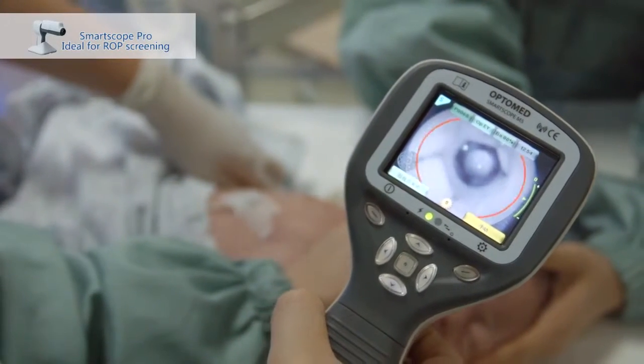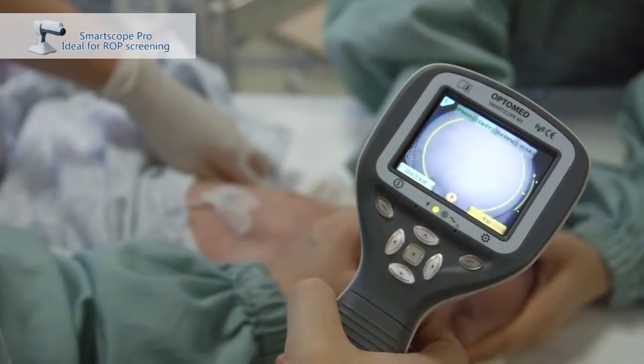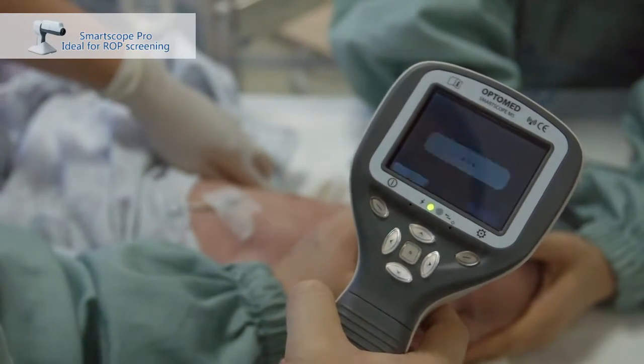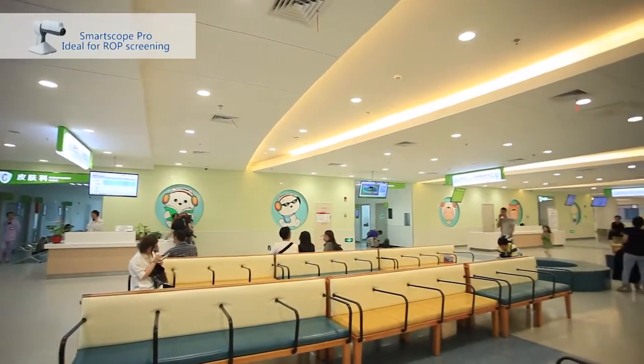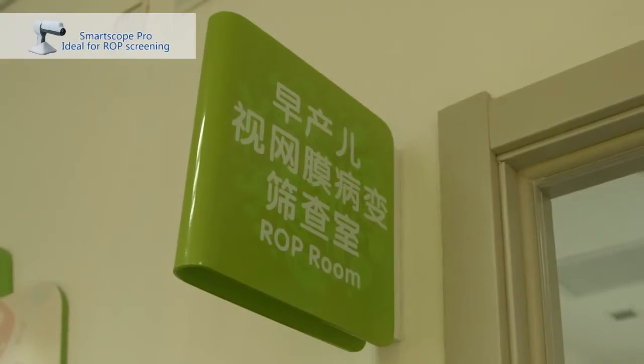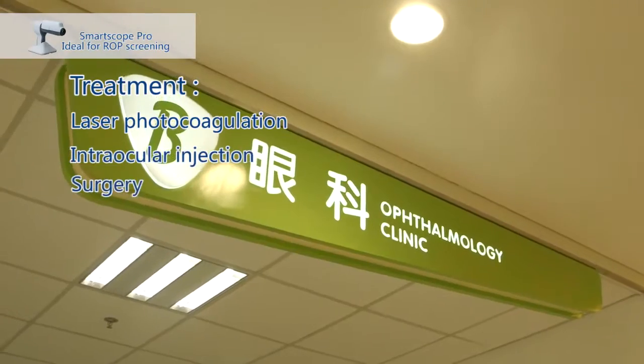When anything suspicious is observed, capture the image immediately. Further suggestion will be prescribed. Treatment including laser photocoagulation, intraocular injection, and surgery.